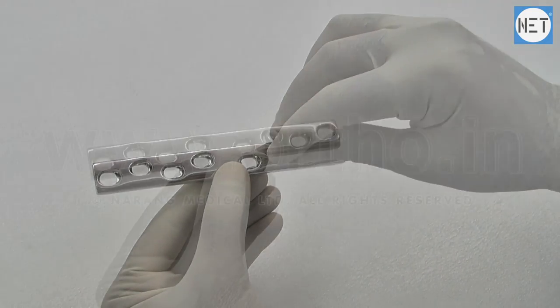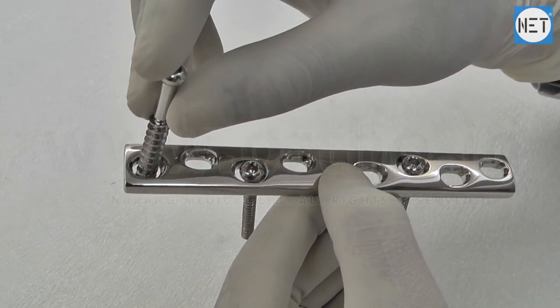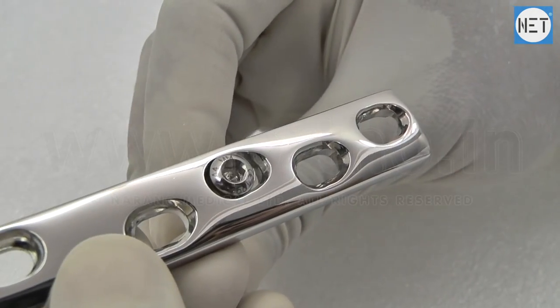All holes of the plate allow 4.5 mm cortical screws, and end holes of the plate allow 6.5 mm cancellous screws.